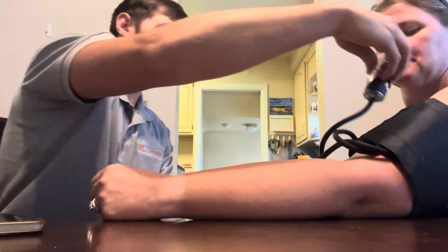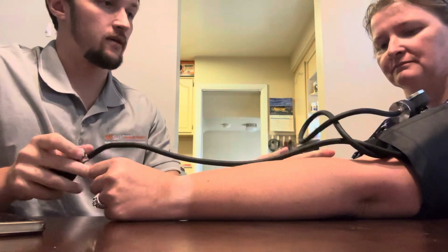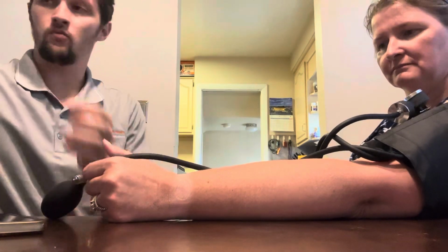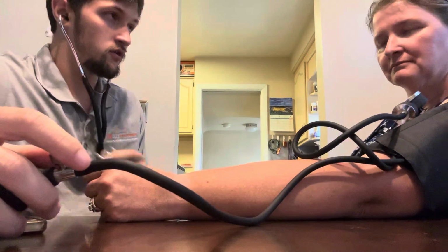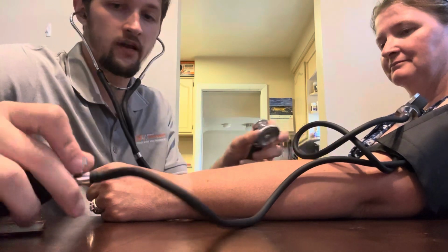So your arm has been laying on the table for around a minute, which is the correct amount of time that we want it to be positioned there before we start taking it. So all I want you to do is just breathe in like normal, just kind of stay as relaxed as possible.